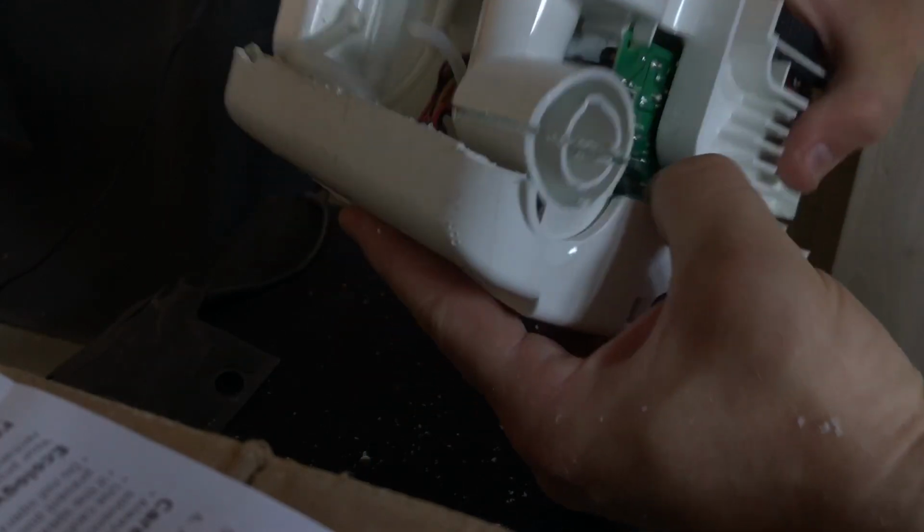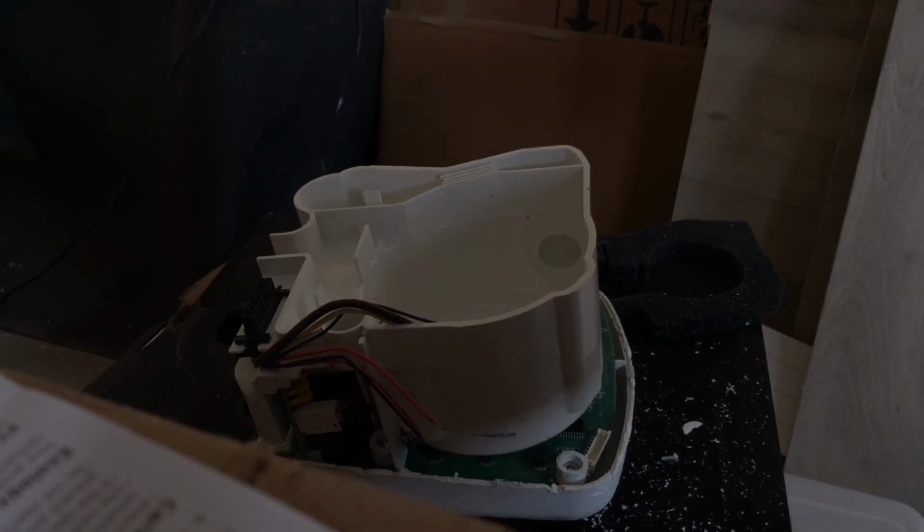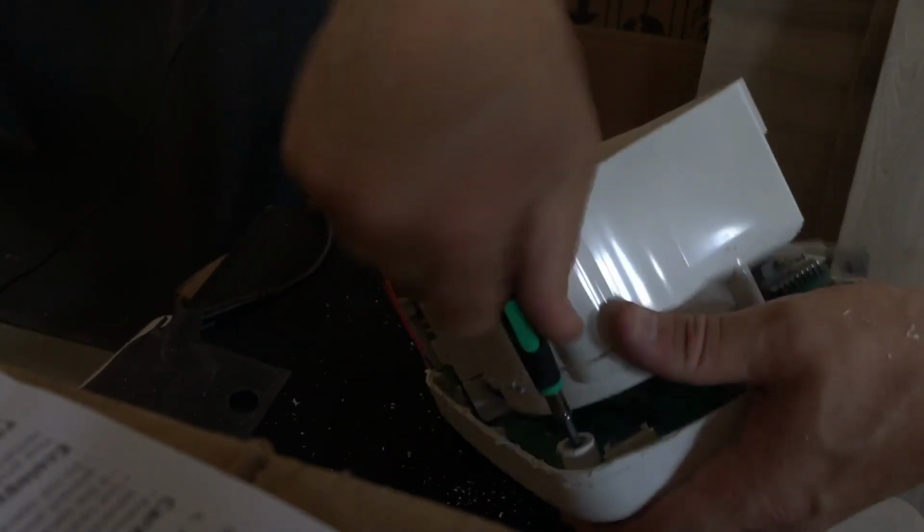What's holding this thing down? I'm pretty sure I cut all the screws on this thing. But I can't open it still. Yeah, it's hanging in there. Oh, it's probably this. Give me a second. It's just held by a couple of spots in the corners here. If I can find the proper Torx, I will open the last bit. Here's one. Get this open. There we go. Okay.